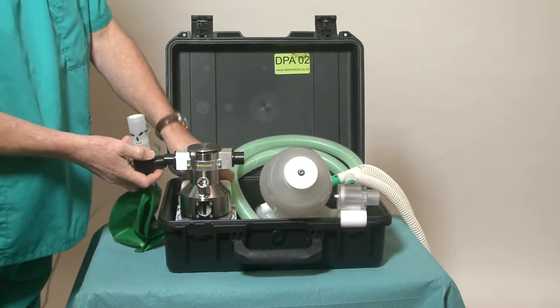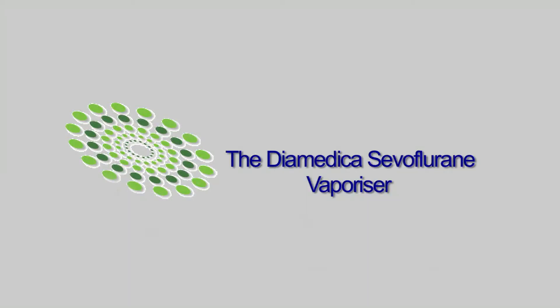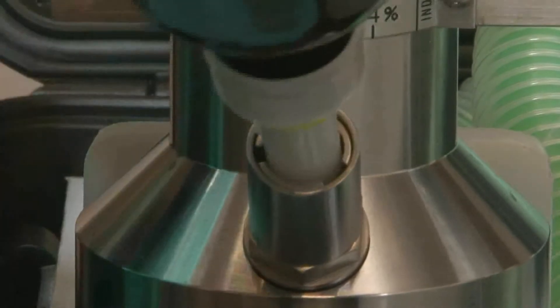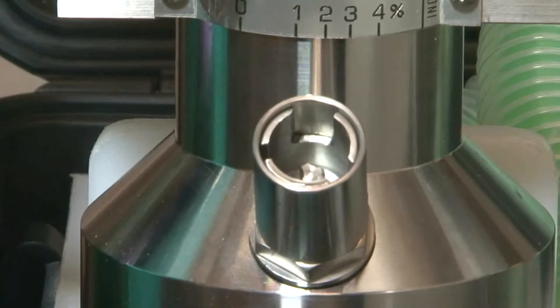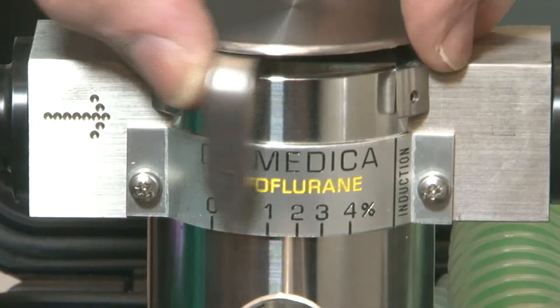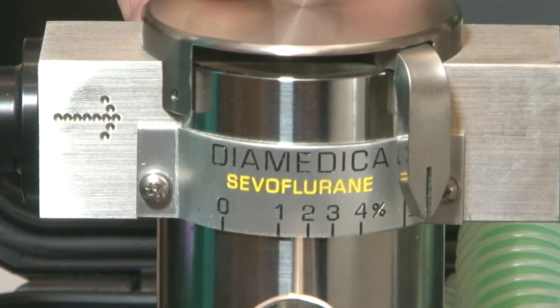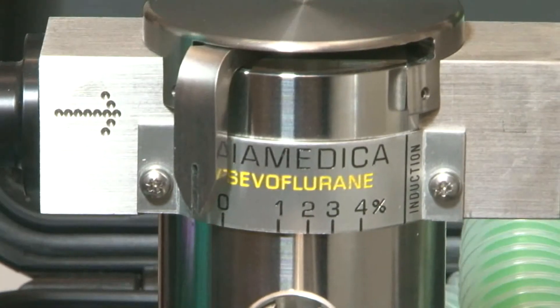A sevoflurane vaporizer is available on request. If the sevoflurane vaporizer is fitted with key fill, it is simply filled by pushing the bottle into the filler cap. The vaporizer can be emptied in the same way. The settings on the sevoflurane vaporizer are 1 to 4%, and a further setting for induction that will provide a nominal 8%.